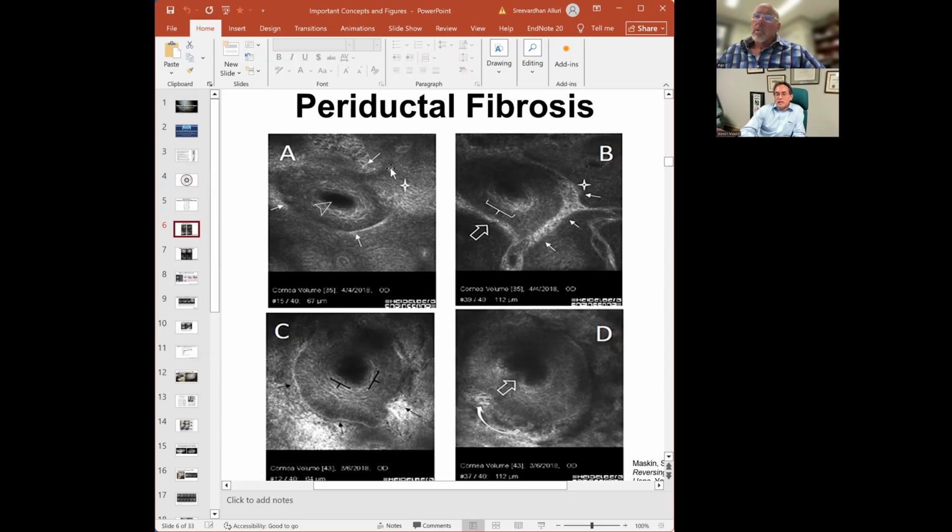Now, as we go deeper, I should comment that these are images from confocal microscopy. We're going to talk later about diagnostics and confocal microscopy. Here's a beautiful example of the importance and helpfulness of confocal microscopy, which I use on the meibomian gland lid margin. I find it very helpful, very effective, and it yields a lot of significant diagnostic information.